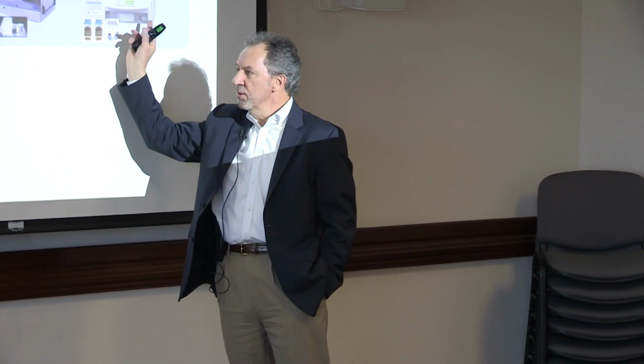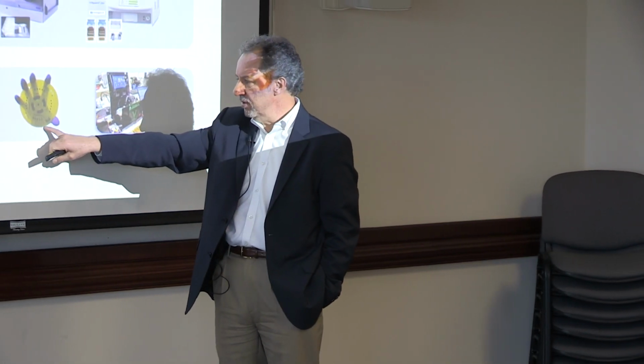So here's the evaluation they did as they surveyed what was available for that particular ConOp. There was a technology gap. They knew what they wanted, but the technology that was available was too costly. So these instruments were $250,000 and $275,000. The consumable was too costly because the cost per analysis was anywhere from $250 to $1,300. And so the technology solution that we pitched to them was get rid of that, put all of the chemistry onto this, and simplify the instrument. And so they bought into that, and we are now in the last 2 months of a 3-year project.